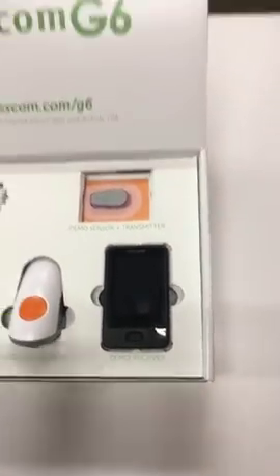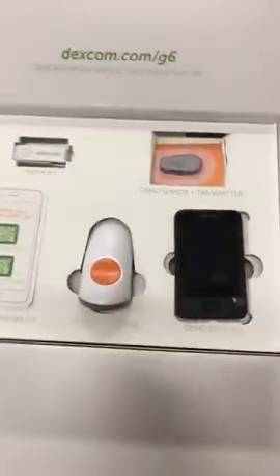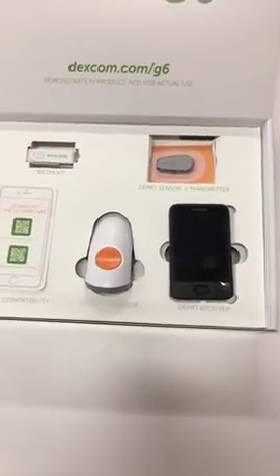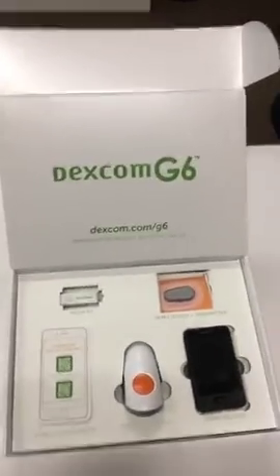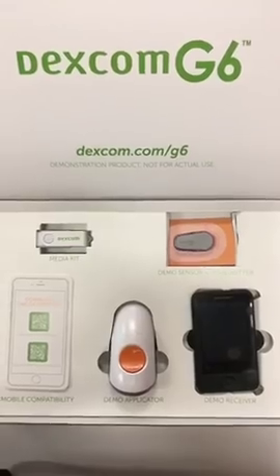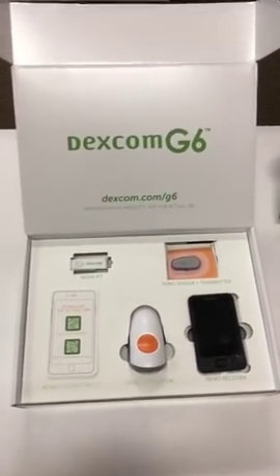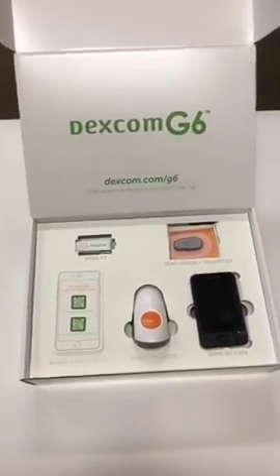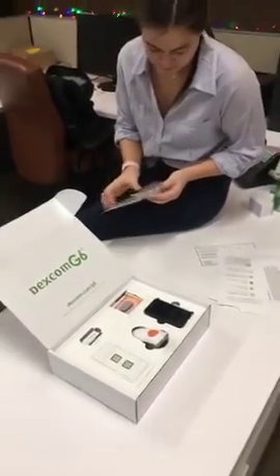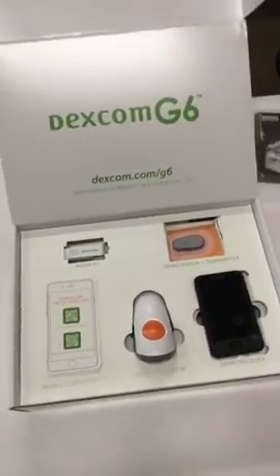Someone asked if we could do a G5/G6 side-by-side comparison, but unfortunately we don't have a G5 on hand right now. People are asking lots of questions about price and accessibility — we have the same questions and have asked Dexcom. Hopefully we'll have an update in our article soon about whether pricing or coverage will be any different from G5. We've also asked about international availability and whether there are approvals pending internationally, since the FDA approval is just in the United States right now.